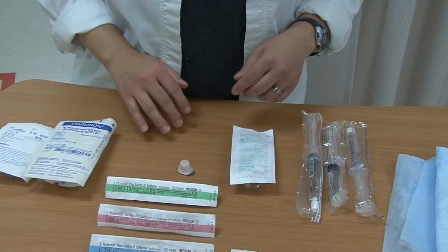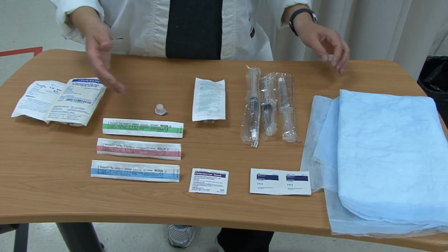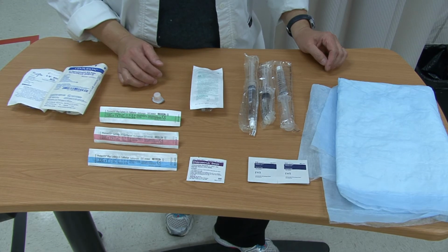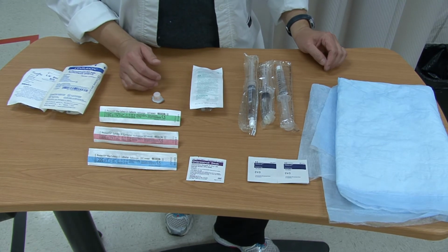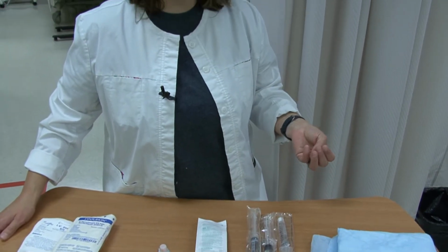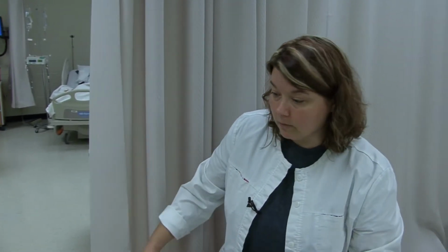So we've discussed some equipment that you might need to bring into the room with you before you go. Certainly I'd want to assess the vein, so it would tell me the appropriateness of the IV catheter that I'm going to need. So now we're going to switch over and assess Mr. Smith's arm and his veins and see which ones we might use, and then we'll determine the equipment that we will go with.